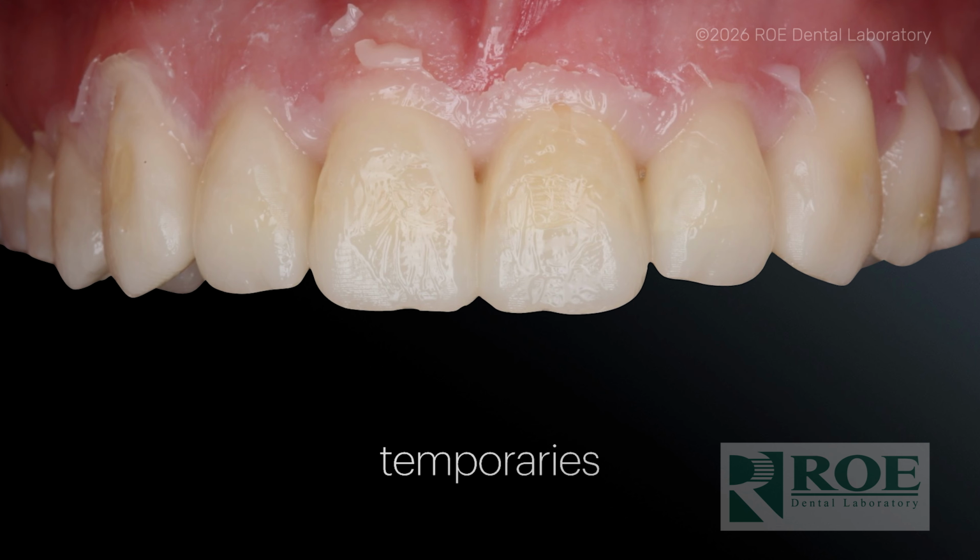And I think part of this is because I don't know about you, but I freaking hated these types of temporaries, our bisacryl temporaries. I swear every time I did these, same problem every single time. I put the bisacryl on and I pull it off, and where are the voids? Every single time, without doubt, they're always on the incisal edge of number 8 and 9. I have no idea why. My technique must be terrible, but that's where I get bubbles every time. And then oftentimes we're under reduced because we're trying to be conservative dentists, and so we get show through.